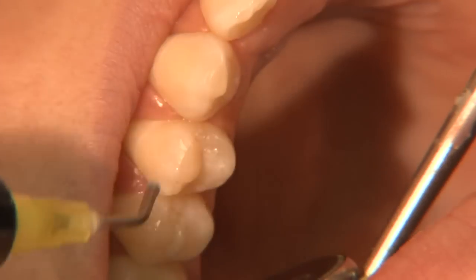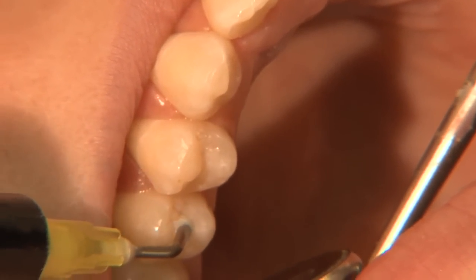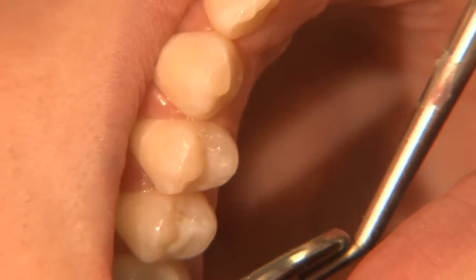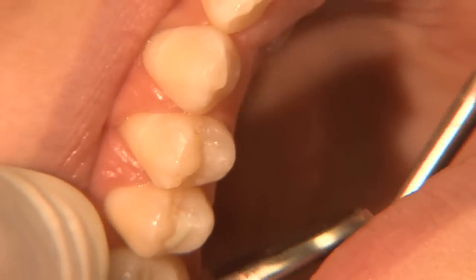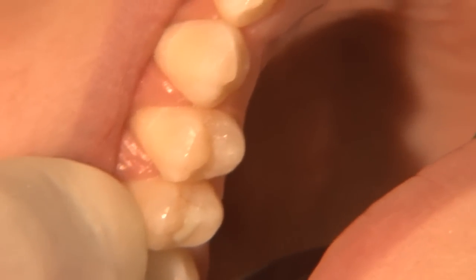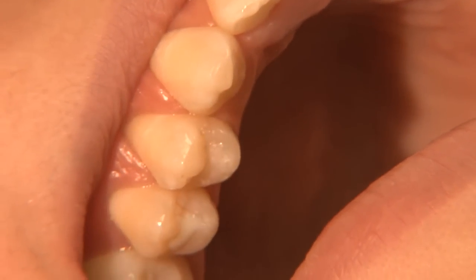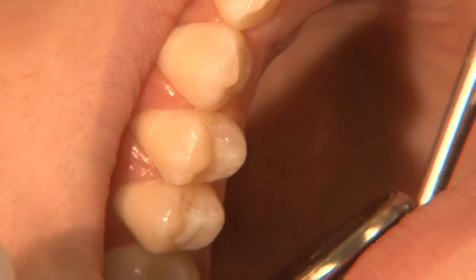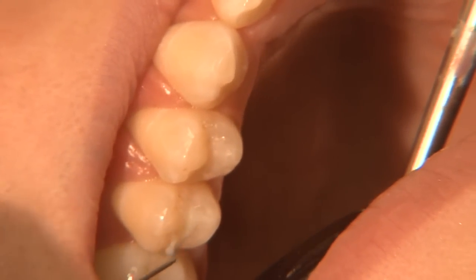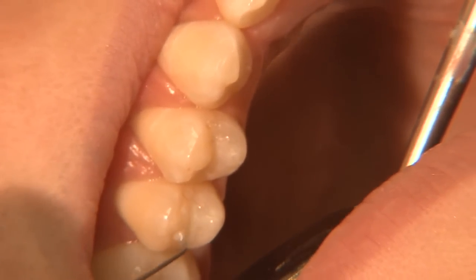As you can see on the application to the tooth, it comes out very opaque — you can see exactly where it is. It is a little thick. The beauty of this material is it does not sag. The patient is leaning back and the material is stable where it's supposed to be. At times, I will apply an explorer to extend it further up and down the pits and fissures of the patient's mouth.